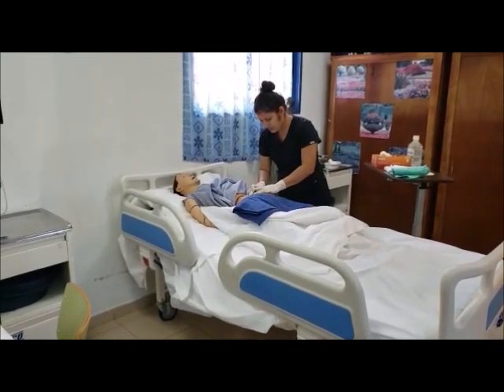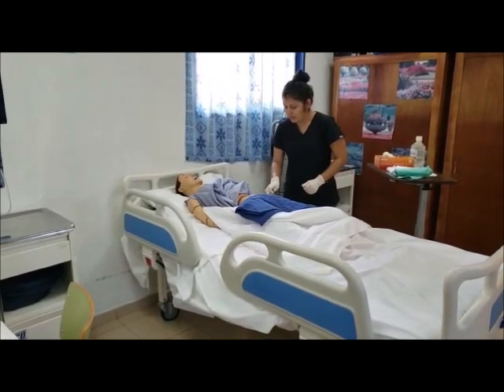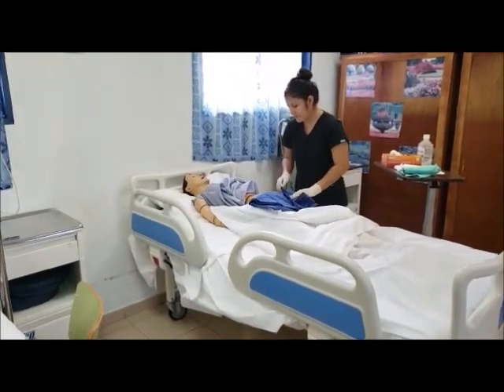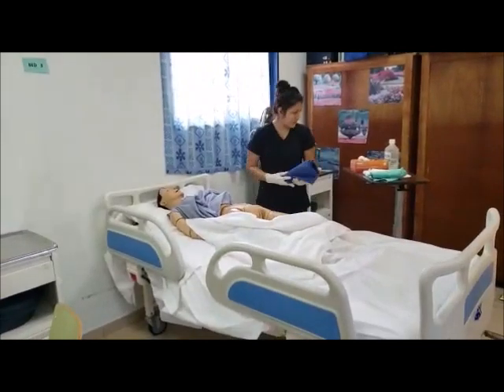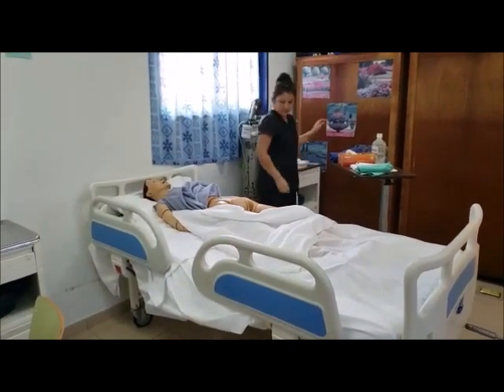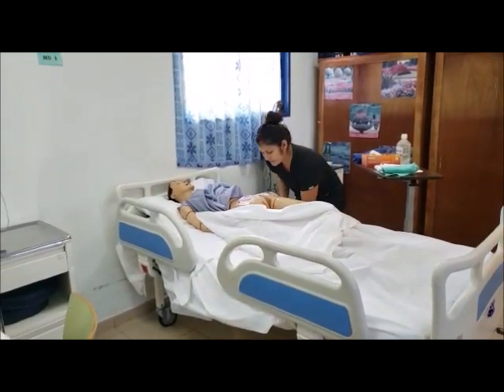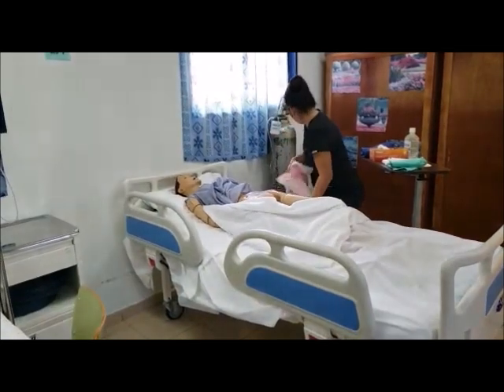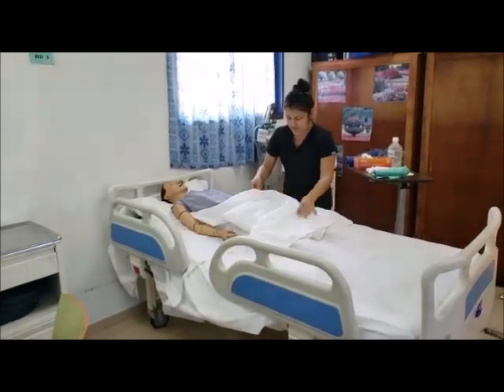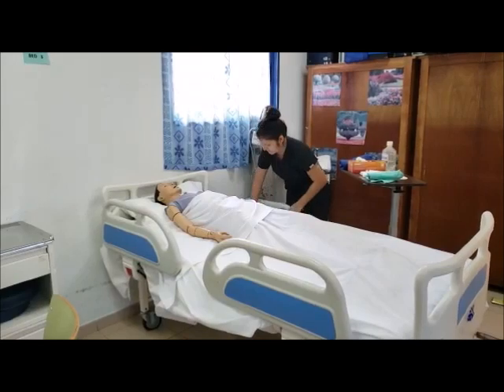Okay, Mr. James, check the adhesive of the pouch for need of extra support. Your bag is good, everything is good, it's properly placed, okay? Doff gloves. I'm going to be removing this. Okay, Mr. James, that was good. Everything is good with your stoma, no problems, okay? Thank you.